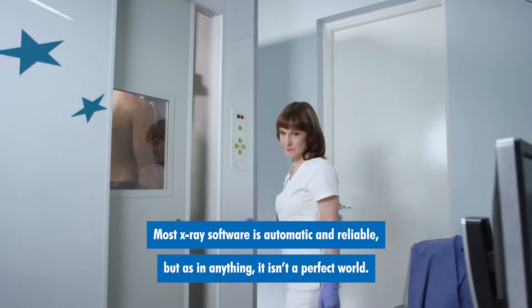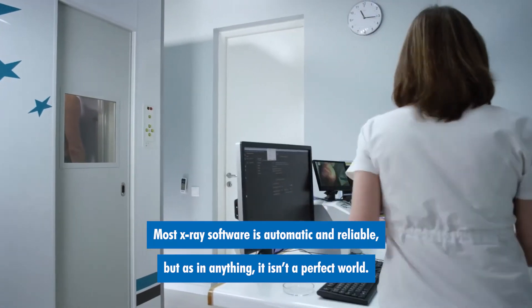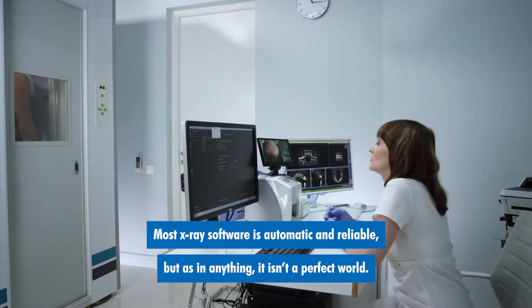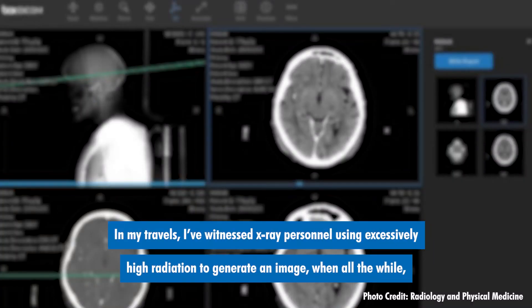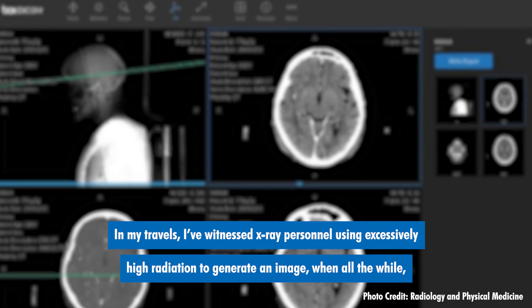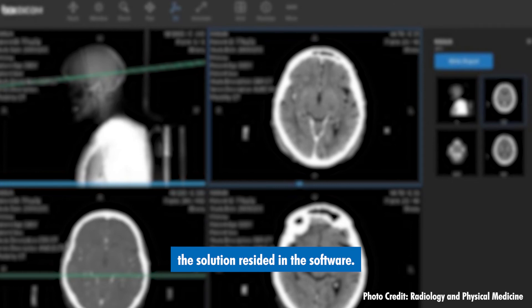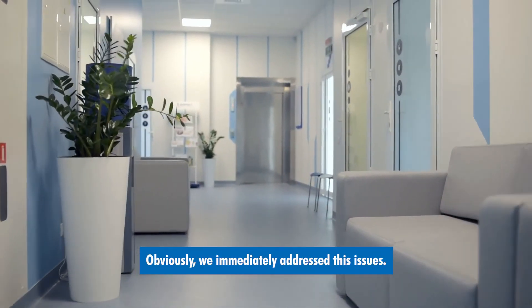Most x-ray software is automatic and reliable, but as in anything, it isn't a perfect world. In my travels, I've witnessed x-ray personnel using excessively high radiation to generate an image, when all the while the solution resided in the software. Obviously, we immediately address these issues.